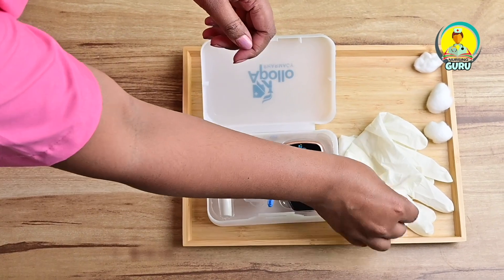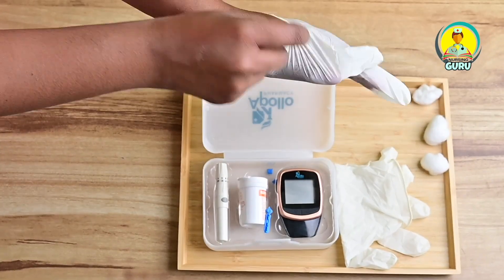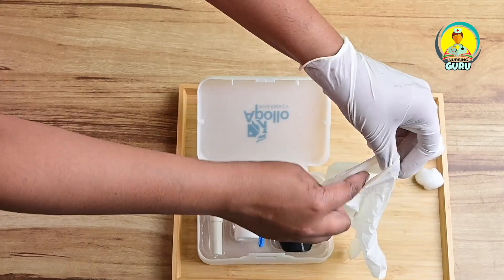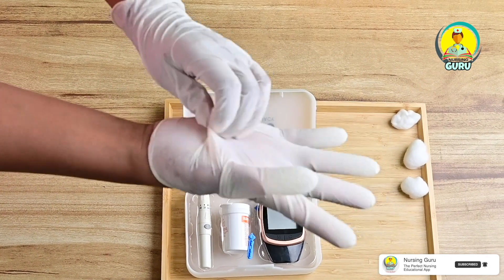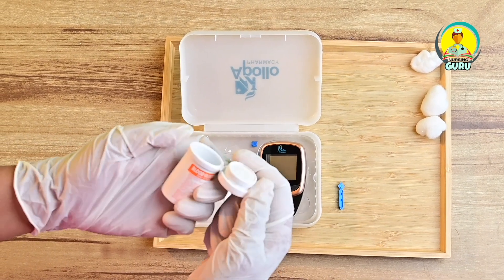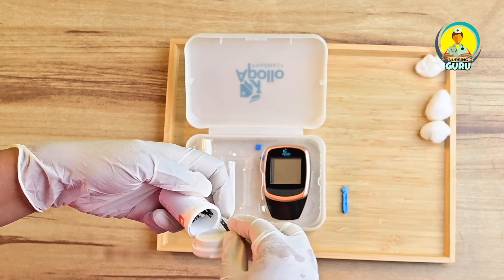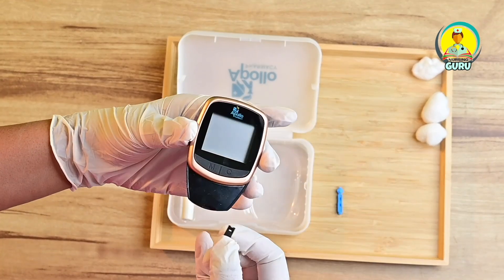Then wash your hands and wear disposable gloves. Disposable gloves may not be compulsory as per hospital policy, but they help prevent the spread of microorganisms and protect from exposure to blood and body fluid. Next, remove the test strips from the container and recap the container immediately. Then turn on the glucometer monitor and insert the strip.